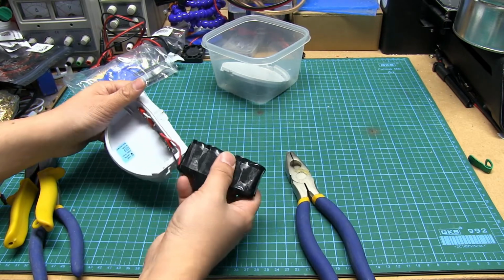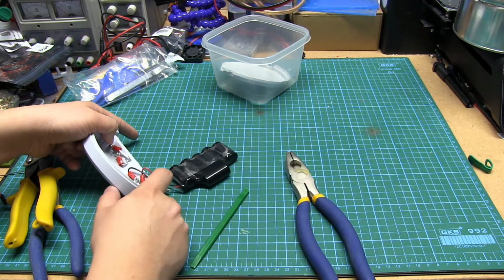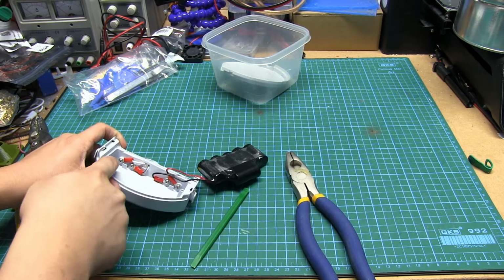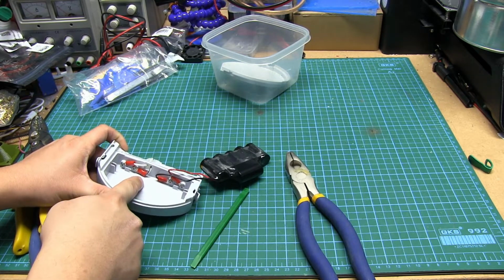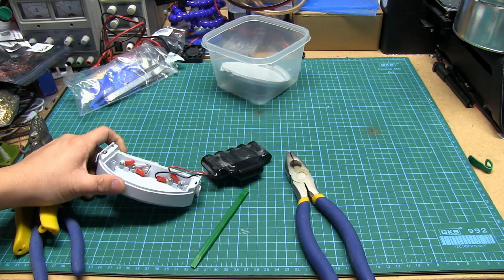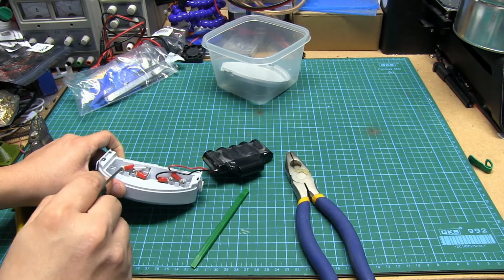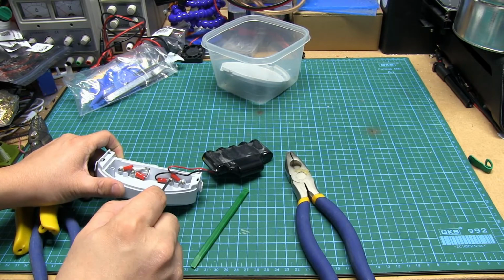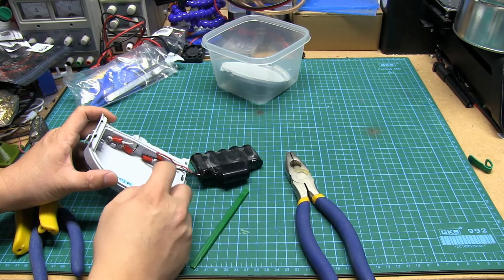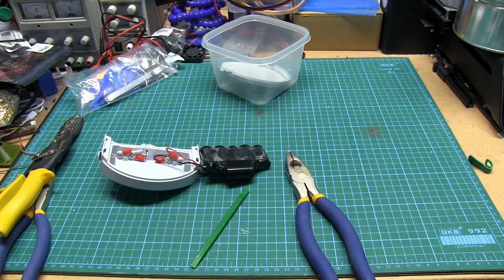Alright. Just some double-sided adhesive tape. And two screw terminals. It's kind of curious because how do you tighten those screws without being able to get a screwdriver in here? You must have like a ball head to squeeze into here and be able to tighten them. Either way, I'm going to snip these off and tape off the positive. So let's do that first.